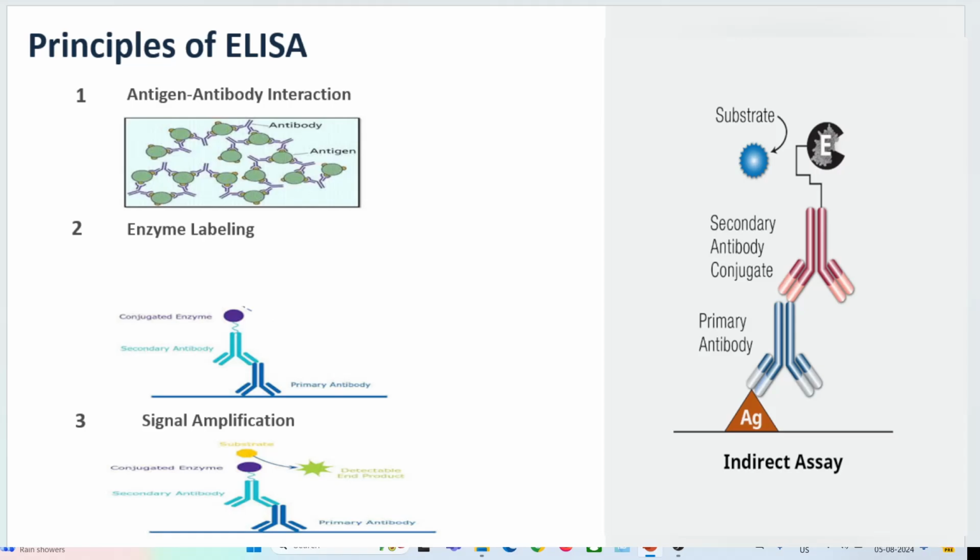His serum sample will have certain antigens, which give positive results for the HIV. Let's say he has certain viral particles of the HIV, glycoproteins or proteins, all of it. So we have an antibody which is able to bind to this antigen. So we are making this antibody bind to this antigen.